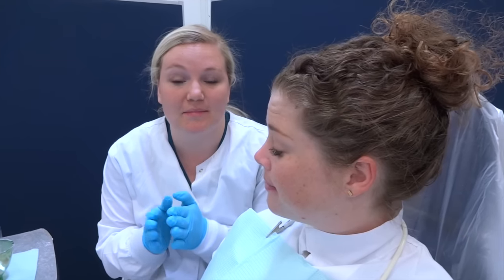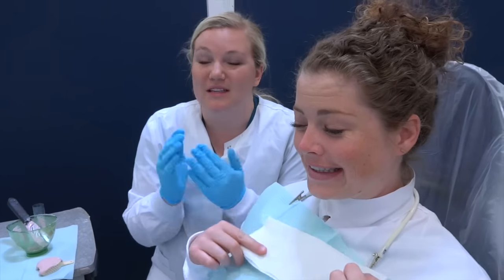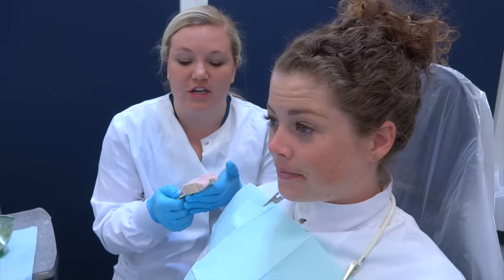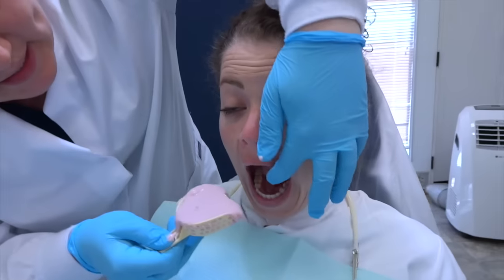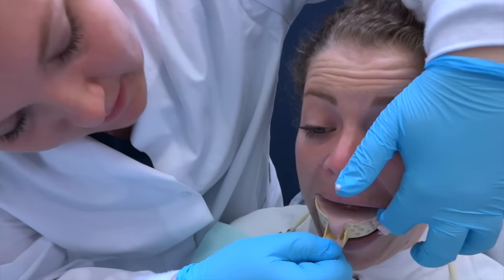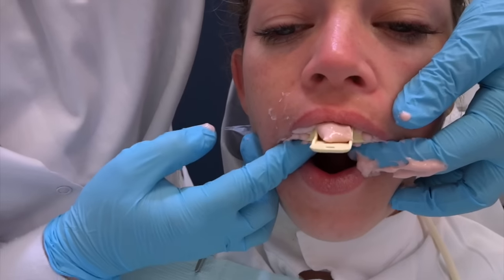Now I'm going to show you how to make a really good impression with no bubbles in the margin and great anatomy. First, give your patient a paper towel so they feel comfortable, since it can be a messy process. When you place the tray, start from the back — the molars — up to the anterior teeth. Don't place it all at once because that will give you bubbles. Have the patient open nice and big, start from the side and the back, close down just a little, put lots of pressure in the back and roll up to the front. As you come to the front, make sure the lip is out over the tray.